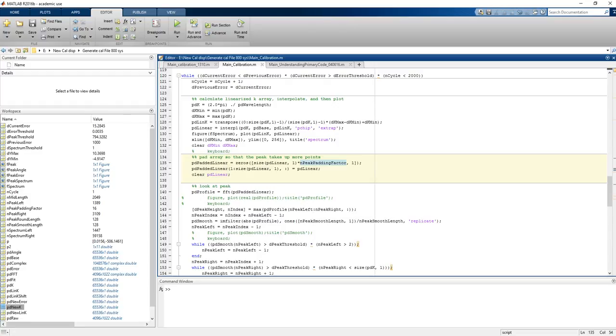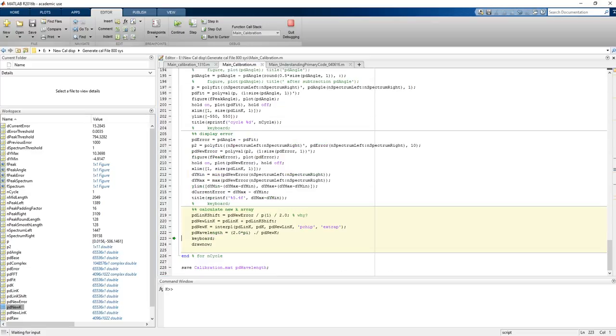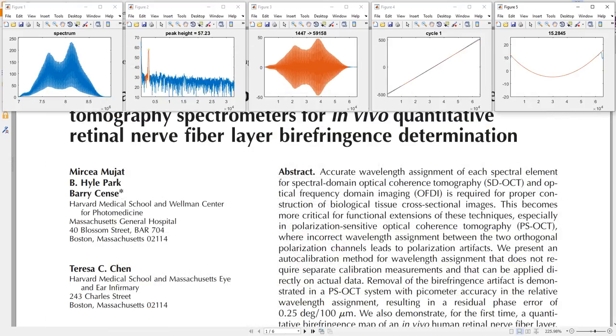So if I run the data, we can see how the output is changing over different errors. For example, for the first data, this is the spectrum, and these are the peaks we detected for the sinusoidal wave.